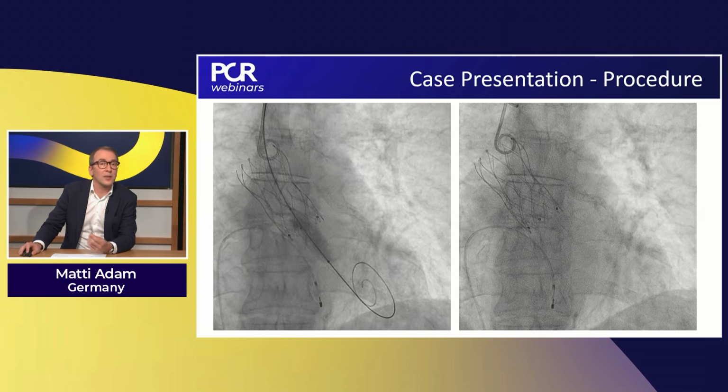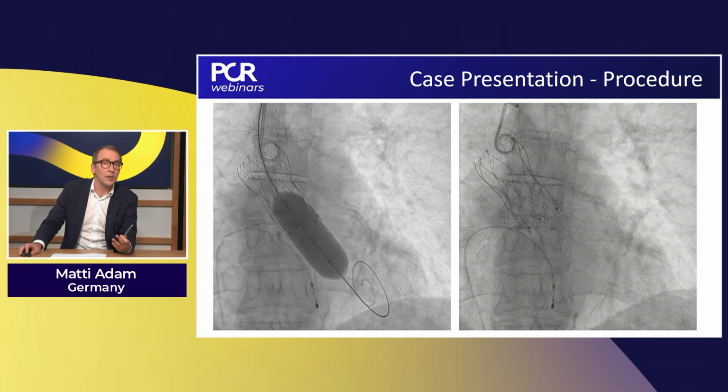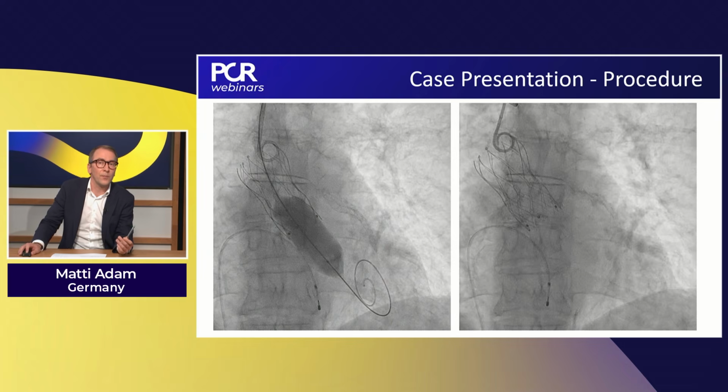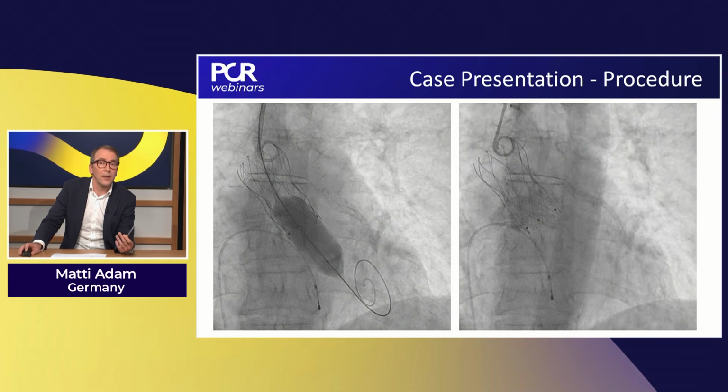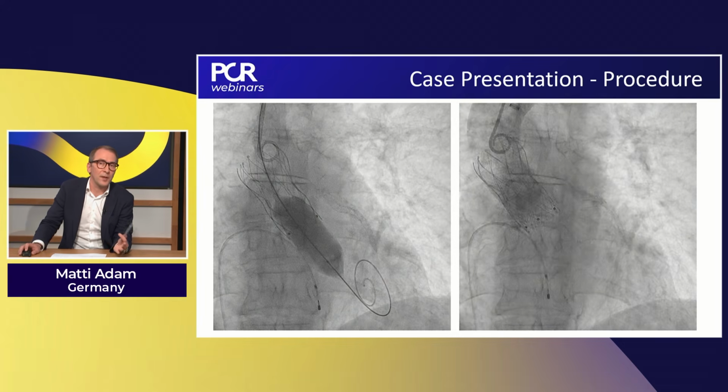So, 20 millimeter balloon postdilatation, rapid pacing, everything is stable. I like the position of the balloon. It really folds up nicely. And then that's the result. Height-wise, super happy, I think, result-wise.